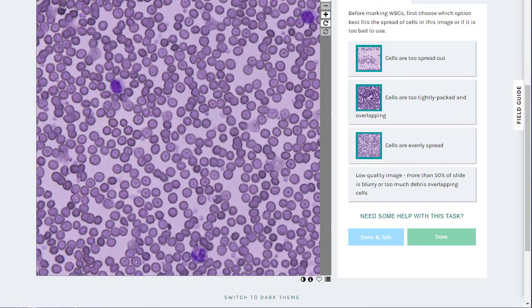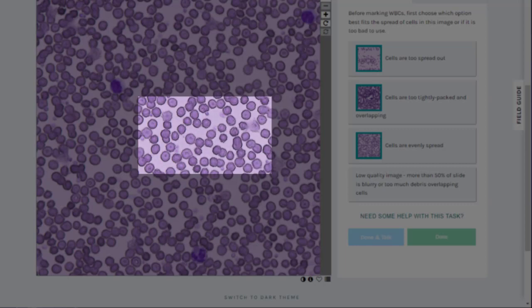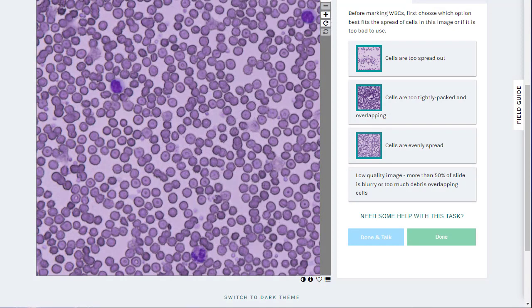Most of the cells you'll see are red blood cells. They're the ones that look like donuts. Depending on the stain used, they might have a dark border around their edges. Don't worry if these are the only cells you see. We're looking for any cells that are larger and/or darker than any of these red blood cells, or ones where we can definitely see a darker mass in them. These are the white blood cells that we need to identify.